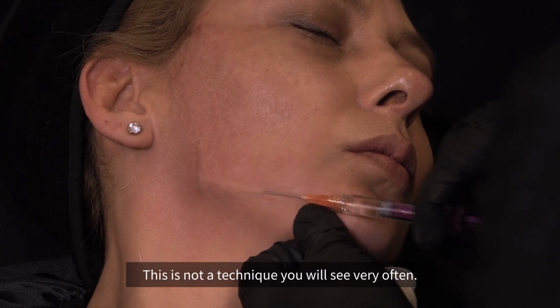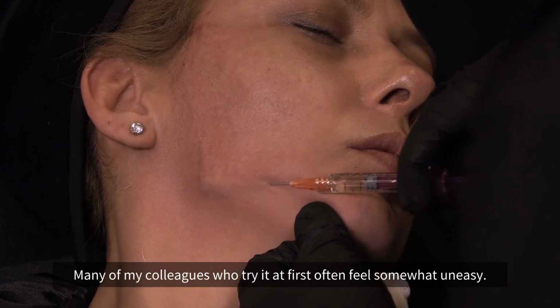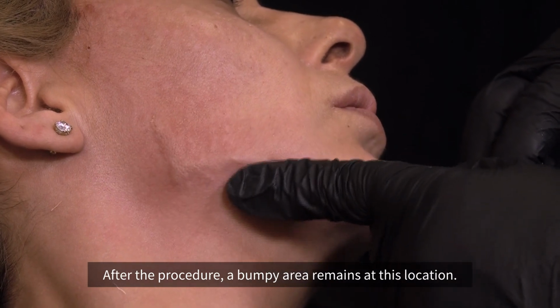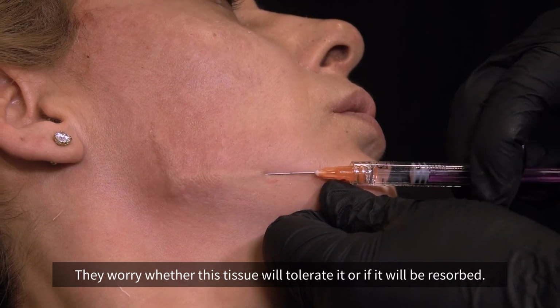This is not a technique you will see very often. Many of my colleagues who try it at first often feel somewhat uneasy. After the procedure, a bumpy area remains at this location. They worry whether this tissue will tolerate it or if it will be resorbed.